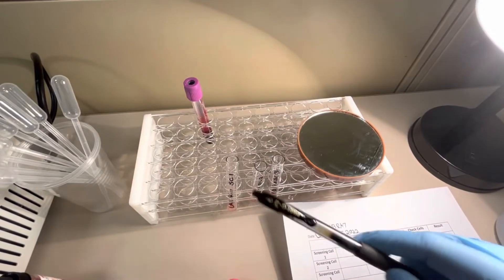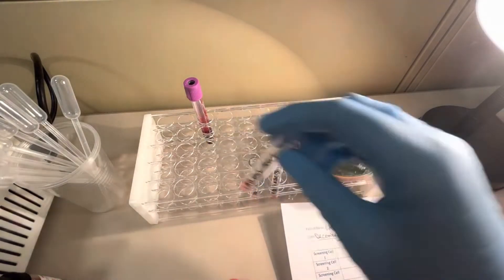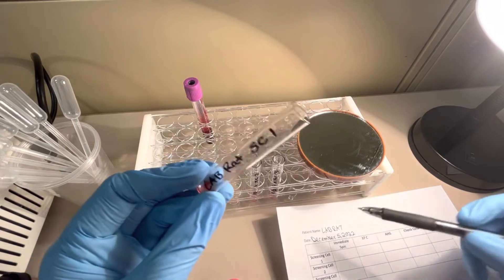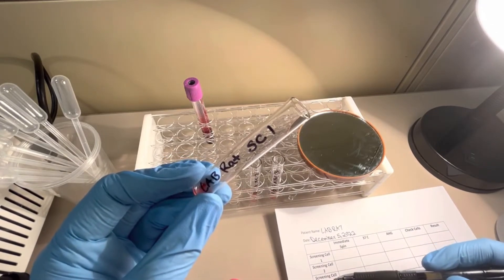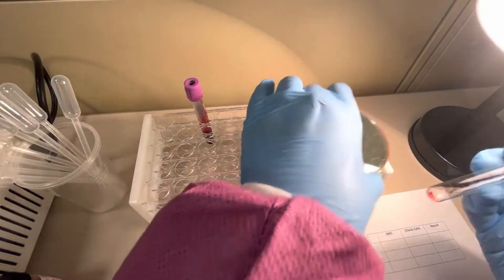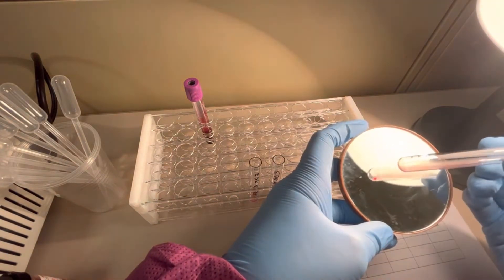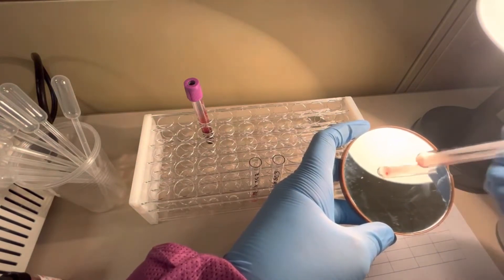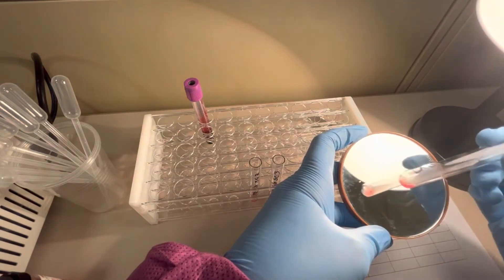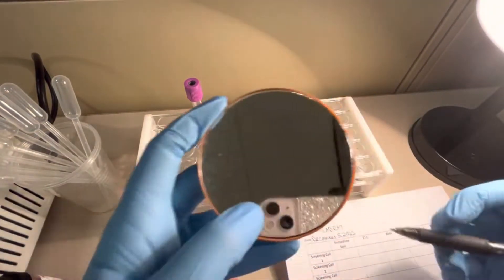I've completed the immediate spin centrifuge step and will now grade the reactions. On my result sheet I have the patient name, date, and columns for screening cells one, two, and three across the phases: immediate spin, 37°C, AHG phase, check cells, and result. Looking at screening cell one — gently rotate and shake — this is a negative result, no agglutination. I'll record immediate spin zero for screening cell one.